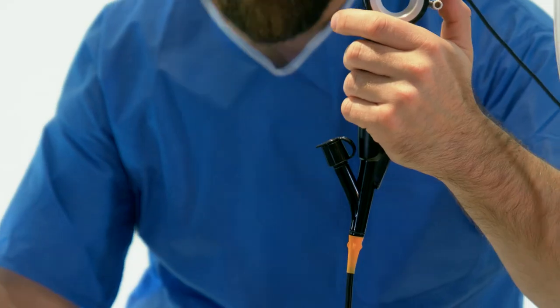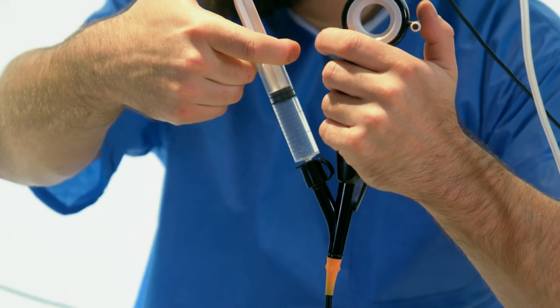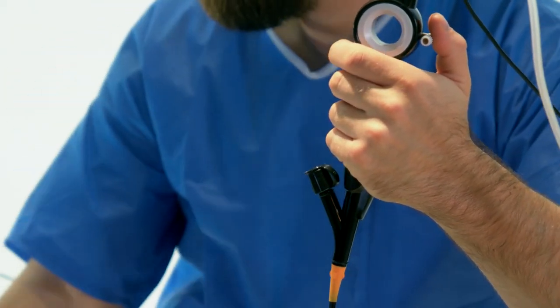A solution can be instilled and aspirated for clearing secretions. When using suction, the syringe must be disconnected before.